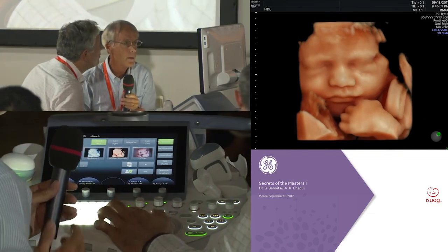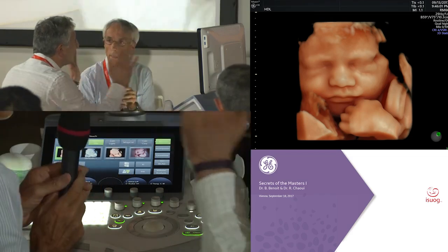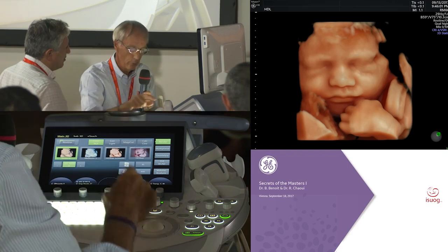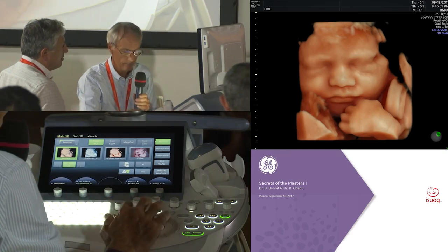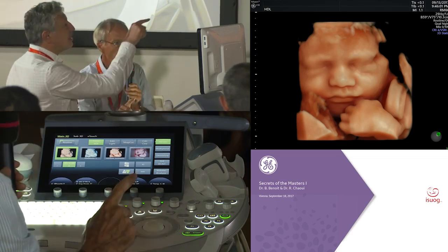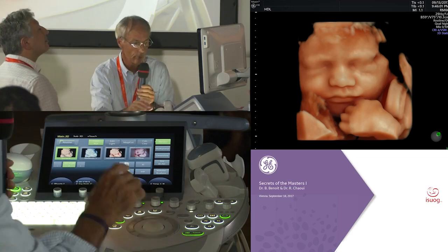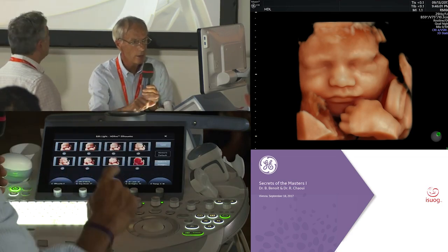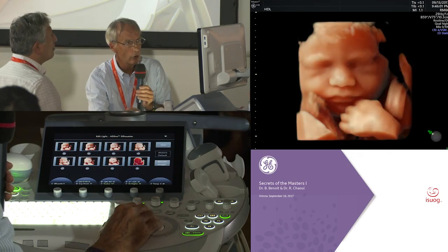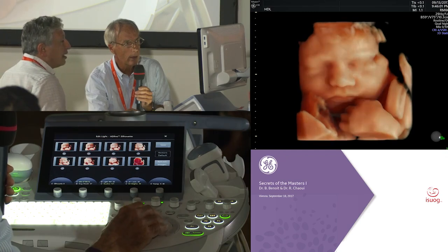Yeah, but the light here is on the tip of the nose and it's like a frontal light. We can see where exactly the position of the light is. It's here. It's not exactly in the front. The lower part on the right is the light. This is the position of the light. And if you want to change it, you just move the trackball and you can change.